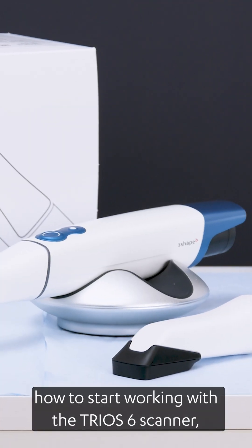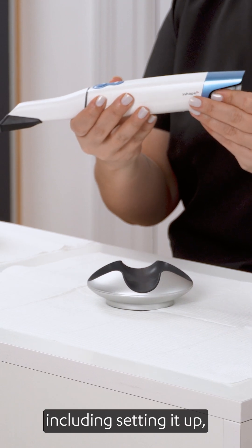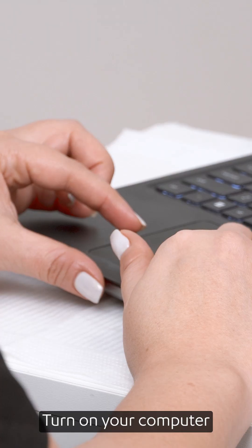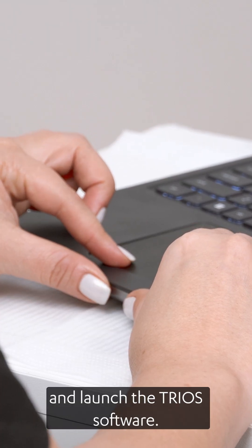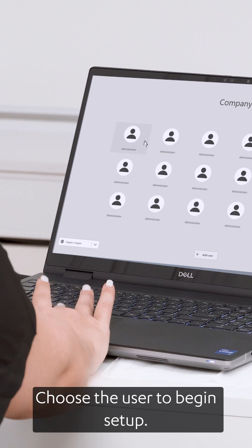In this video, we will show you how to start working with the TRIOS 6 scanner, including setting it up, scanning and maintaining hygiene. Turn on your computer and launch the TRIOS software. Choose the user to begin setup.